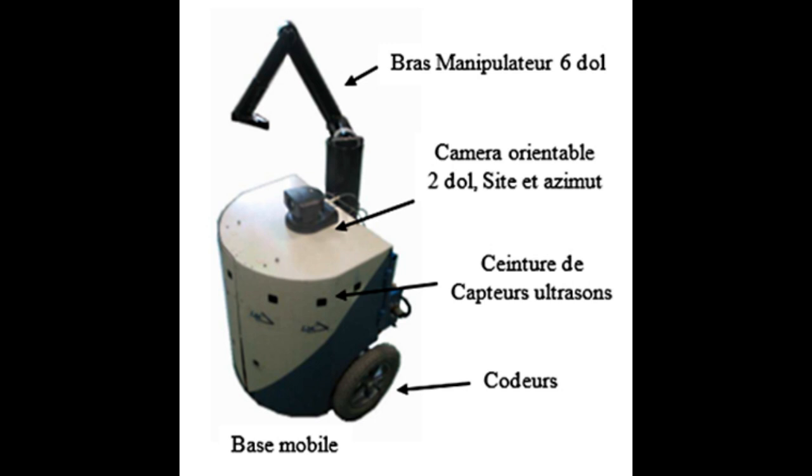Project 1, the block diagram in the poster illustrates the link between the user and the assistance robot. This link can be broken down into four main control modes, depending on the person's residual abilities and the robot's autonomy capabilities. Pure teleoperation: the user controls the robot directly, without assistance.